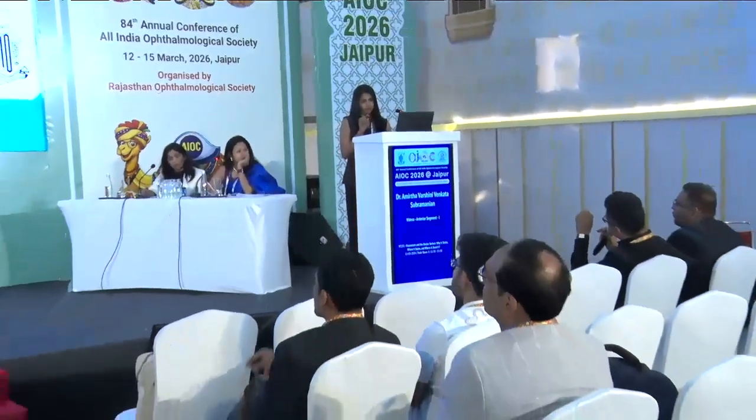And in case of fluorescein staining, did you not miss a subtle foreign body, a subtarsal foreign body or some kind of micro foreign body on the cornea, if you are not able to delineate it on slit lamp examination? The slit lamp highlights it. So that is one of the important things that was missing from your presentation. Sure, sir.